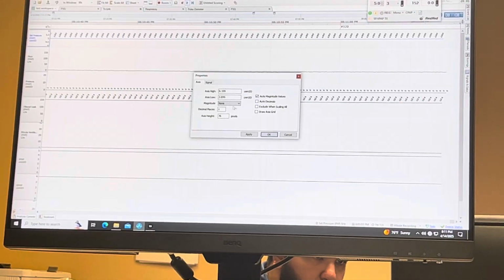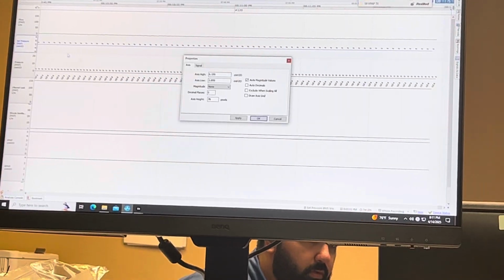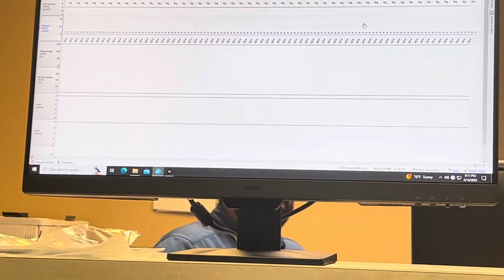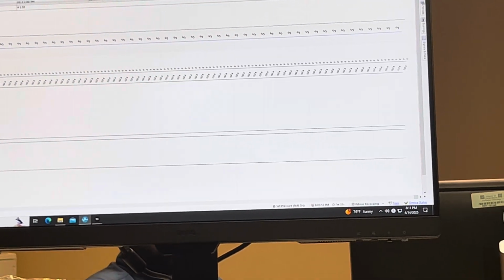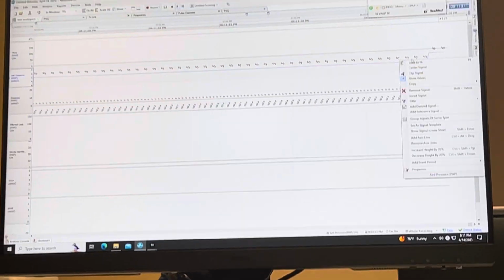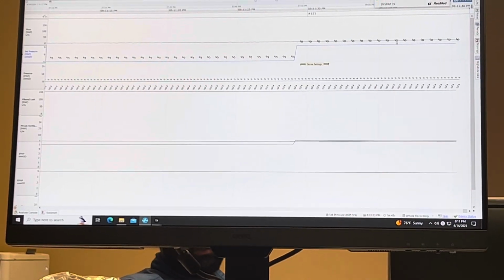The beauty of the digital connection is we get 13 channels out of the TX Link. You get flow, pressure, leak, tidal volume, respiratory rate, IPAP, EPAP, all of that stuff. Right now, with analog connections we only have flow and pressure. That's one thing I like about the ResMed. It gives you the flow, the respiratory rate, and all of that. It puts in a setting tag on its own when it bumps itself up to 6.